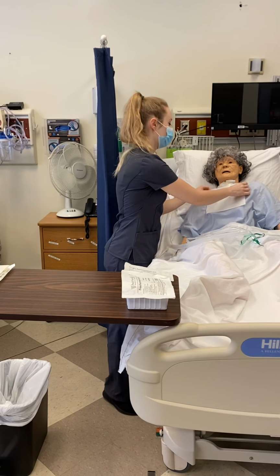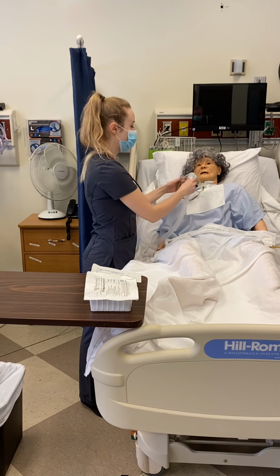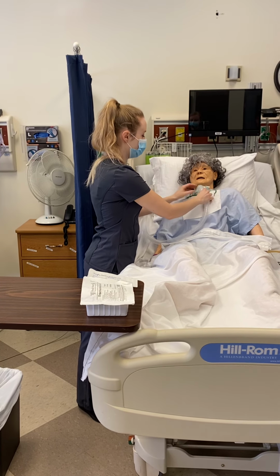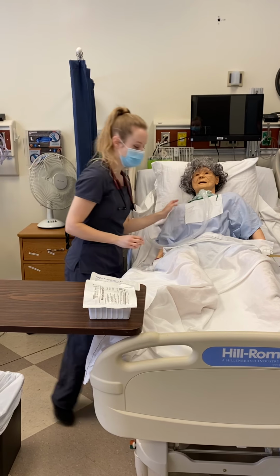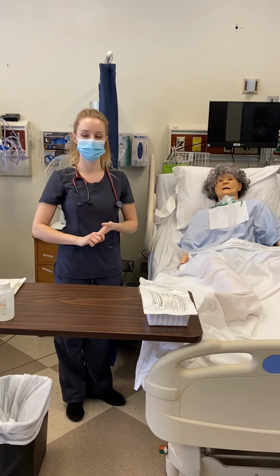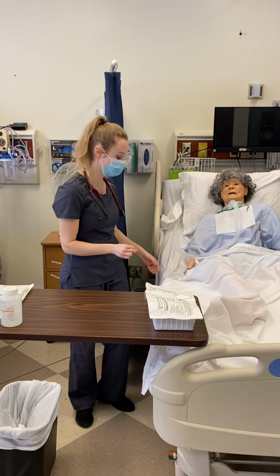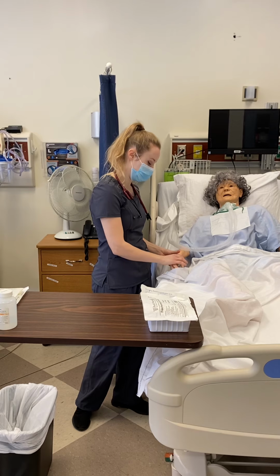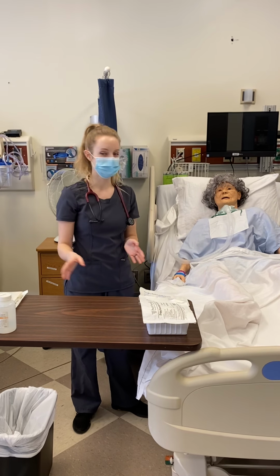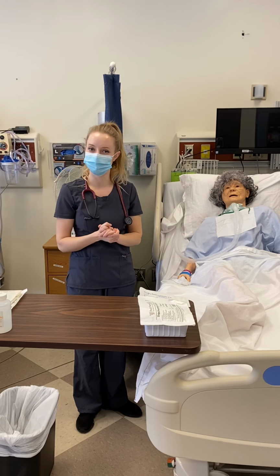Next, I will ensure that there is a towel on my patient's chest and that they are getting hyperoxygenated before we begin. I also want to establish a non-verbal form of communication. In this case, we'll say this is Mrs. Smith. I want to verify her name and date of birth and ask her to raise her right hand if she's experiencing any distress during the procedure so that I know to stop.